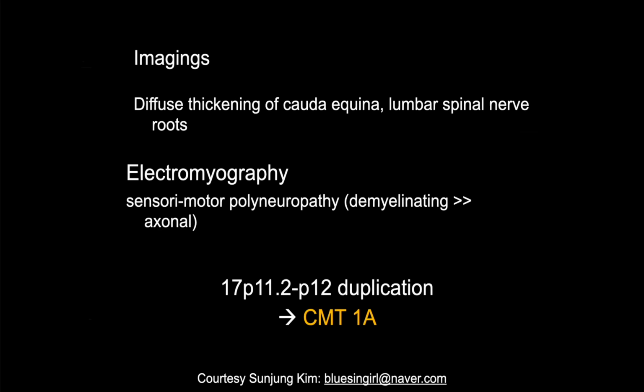So this was Charcot-Marie-Tooth 1A. And now I think this was a few years ago. I think there are more types that have been described now. You tend to get stork leg, inverted champagne bottle, and pes cavus are classically associated with it.